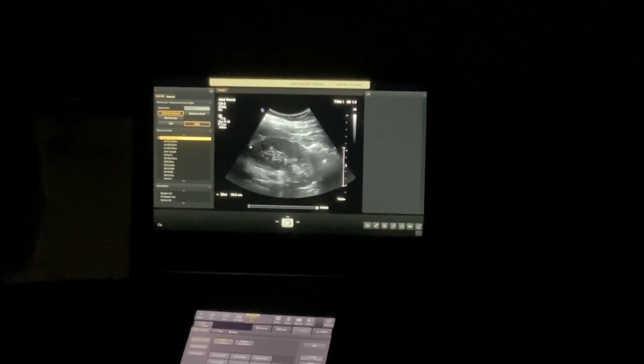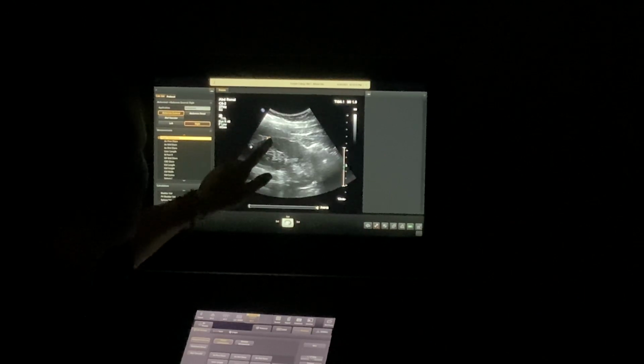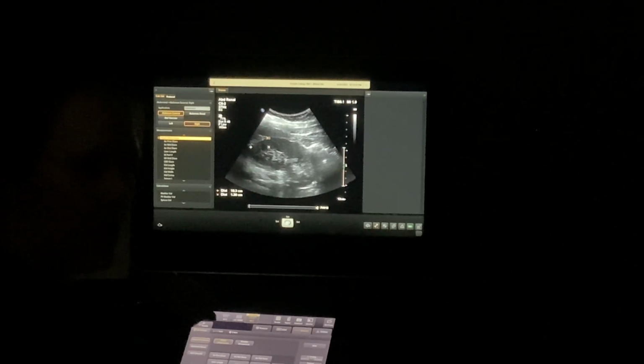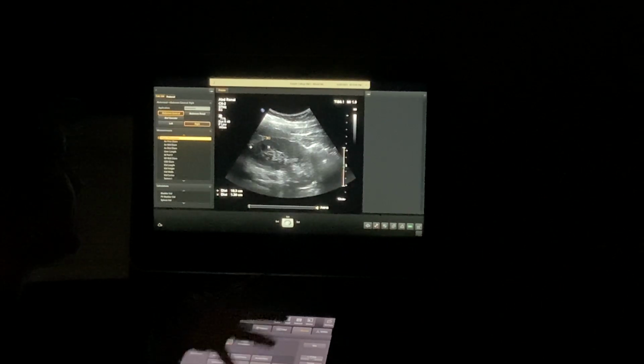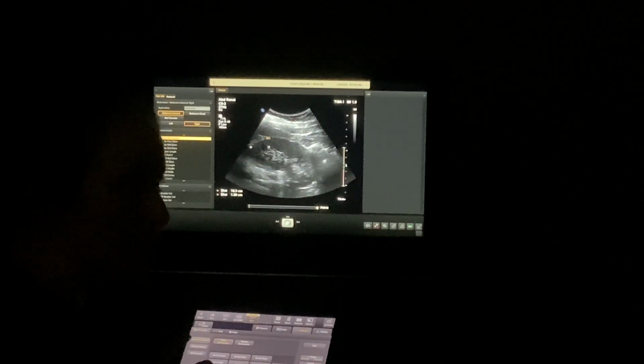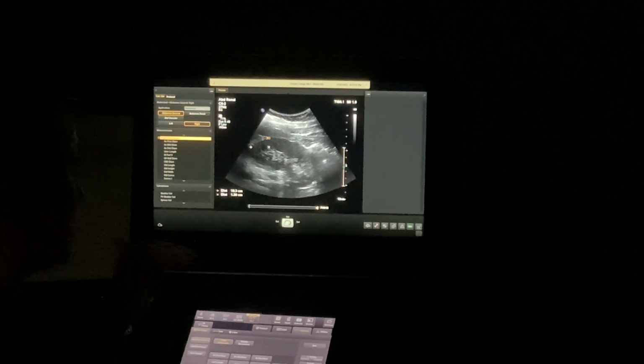If I had to do a cortex measurement, I'm going to go here to here. Are you inner to inner? It doesn't apply when it's not a vessel or a tube of some sort. It is on the edge of the cortex, so it's a margin, not an inner to inner thing. Does that make sense? Inner to inner is only when we're talking about some sort of vessel that transports something, some tubular or fluid-filled structure that you're trying to get a volume or diameter measurement on. We don't consider inner to inner when we do measurements like this. This is just on the margins.